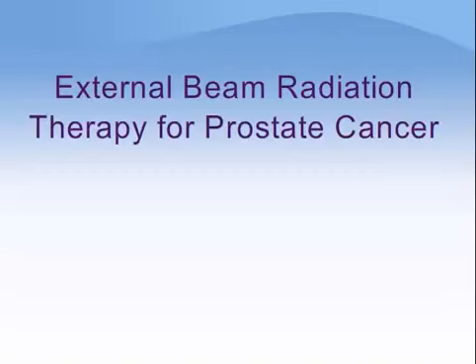Welcome to this educational program. This module discusses external beam radiation therapy for prostate cancer.